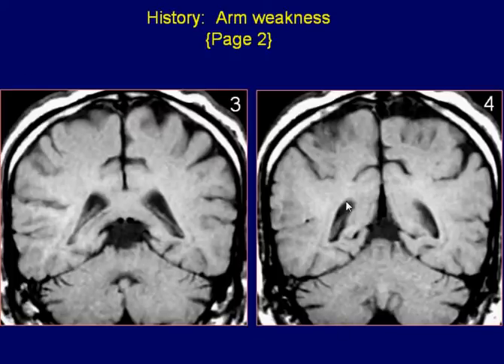Coronal T1-weighted images show the right temporal lesion as a subtle low-signal intensity area.